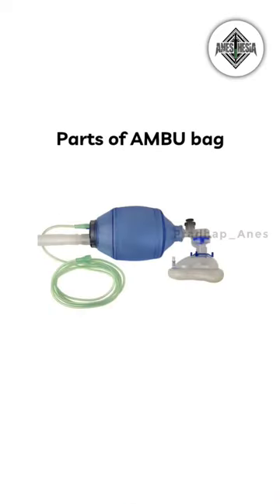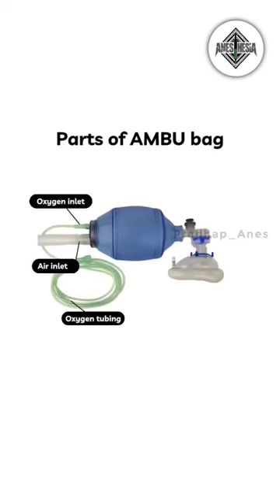Coming to the parts of the Ambu bag. This Ambu bag consists of two inlets. One is the oxygen inlet, where oxygen tubing is connected. The other is the air inlet, where surrounding air enters via this inlet.